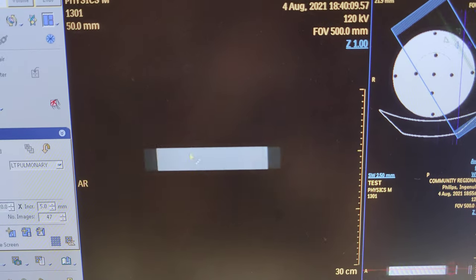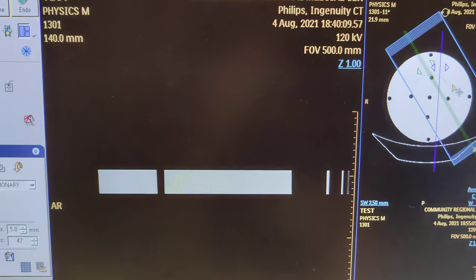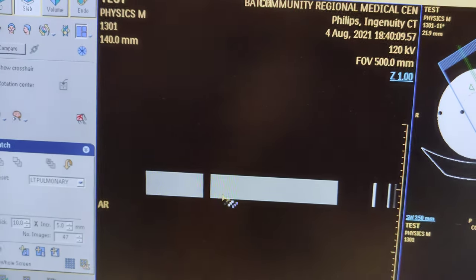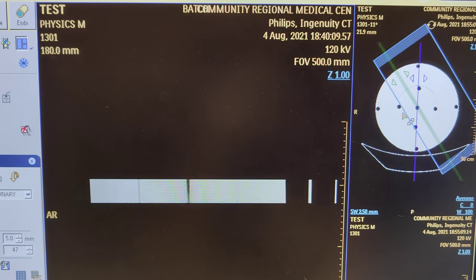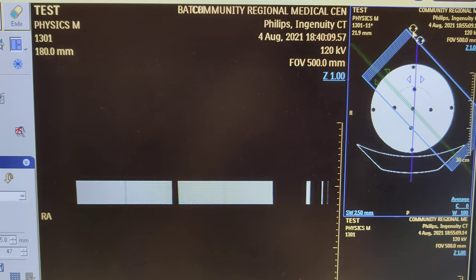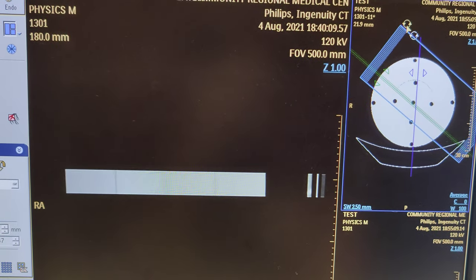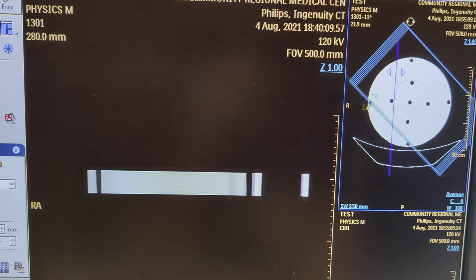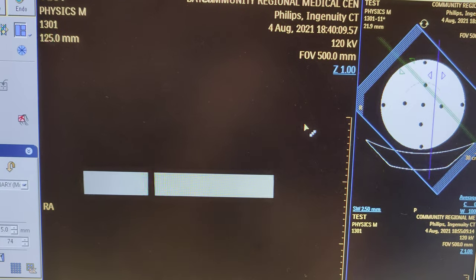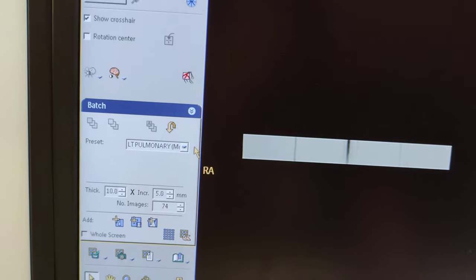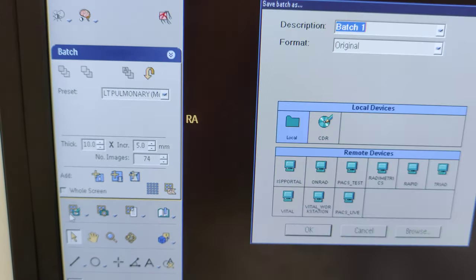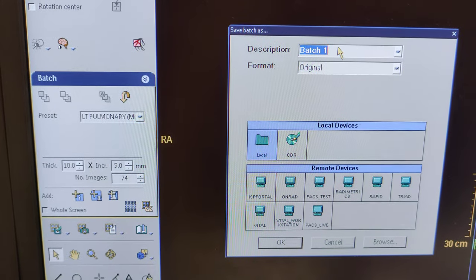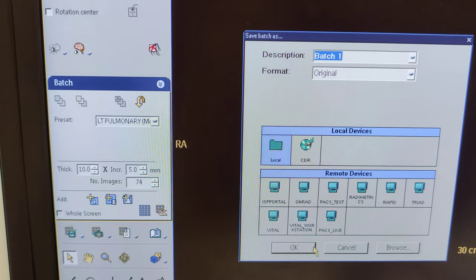That's going to help you scroll. Once you scroll and find your pulmonary, in this case your left side, you're going to want that elongated. You can adjust it to get your left pulmonary elongated with this button over here. Make sure you get all your lung fields and scroll through it to make sure everything's nice. Once it's nice, click this to save it, then label it left pulmonary or whatever you have to label it, and save it.